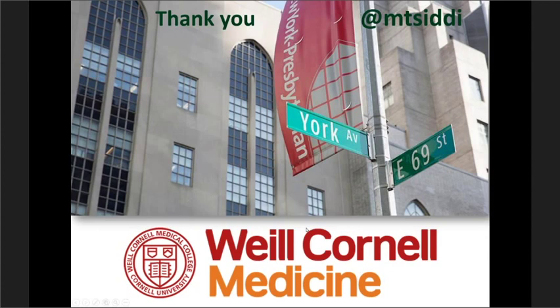Well, thank you very much. That was a fantastic overview of pancreatic pathology, which sometimes could be difficult, and we all end up scratching our heads about some of these cases. I do see there's some questions from the audience, and I'll read them to you.